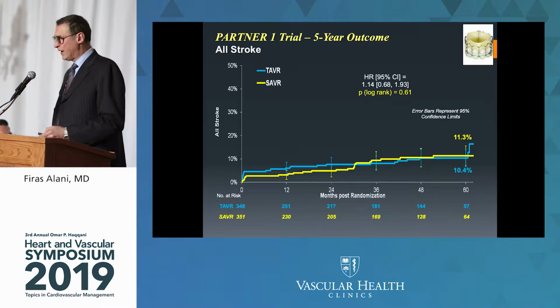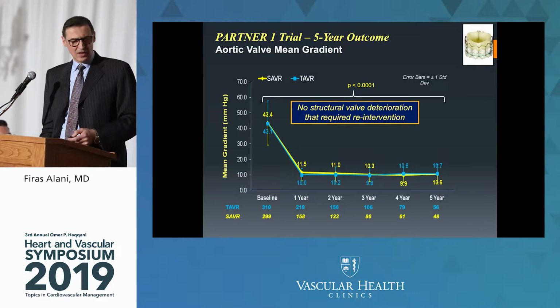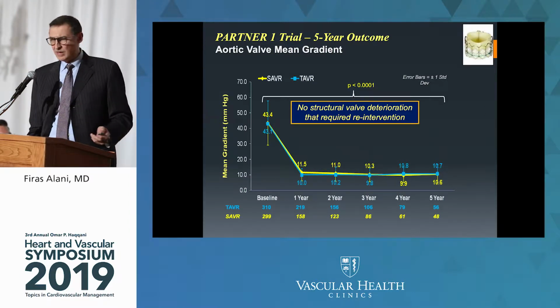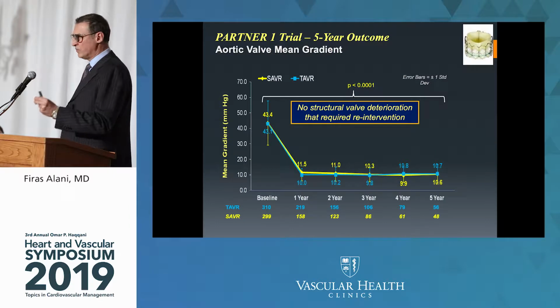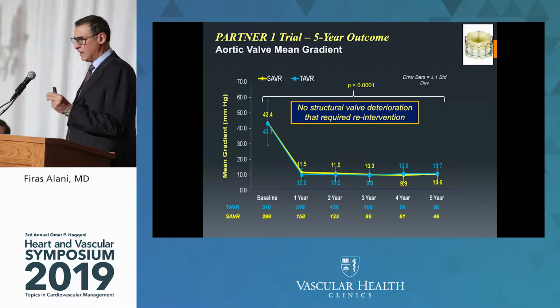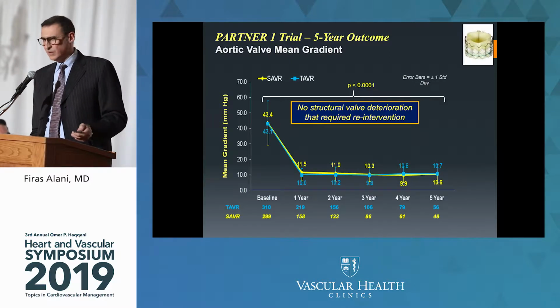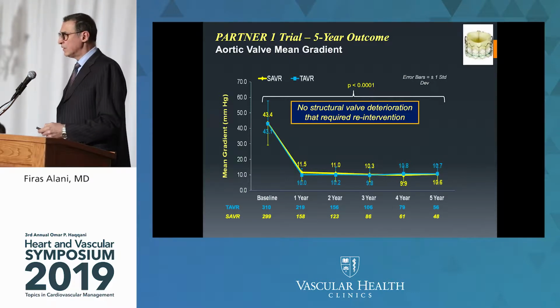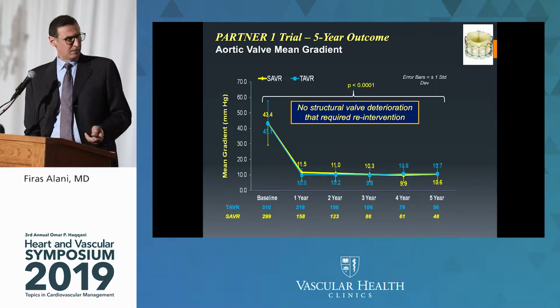All strokes are parallel. And one of the things that was challenged is how durable these valves are. This graph really shows it, among other graphs: the echocardiographic features of these valves, measured by gradients and velocities, and durability. You can see that both sets of valves, the surgical and the percutaneous, have similar functionality out to 5 years. So it's a very durable valve.